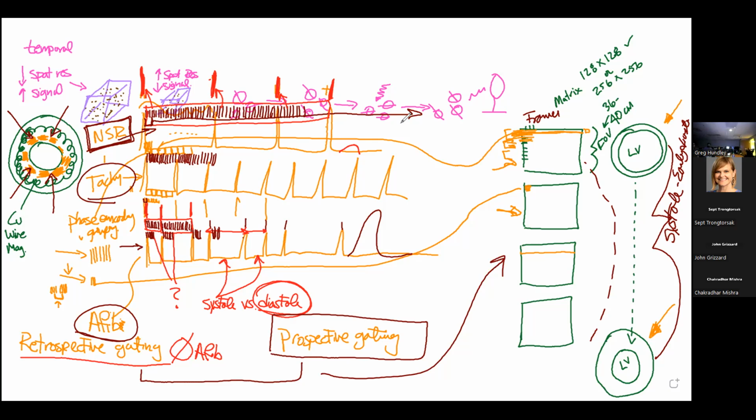Well, here, with all of this technology, you get automatic averaging, right? Because remember how these pictures are created: pieces of information that came over in this period of time, in this period of time, in this period of time, were all being used to fill parts of these images over time. So you get kind of an automatic averaging. It's a really nice averaging technique, but you've got to understand that when you've got an irregular rhythm, you're going to switch to prospective gating down here, because systole, that time interval, is not going to change as this RR interval goes, and that's what you're going to be taking a look at. Okay?